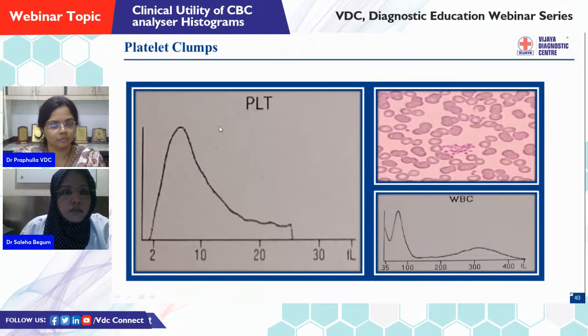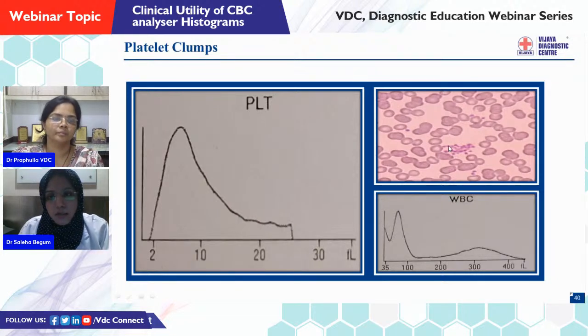This is a graph, a platelet curve starting at the baseline, but as you follow it, it is not ending at the baseline. It means that, as I just discussed, there are upper discriminator causes. One such cause is a platelet clump. You can see it here in the peripheral smear. These platelet clumps are counted as single large particles by the automated analyzer, and hence the graph ends in the middle, not touching the baseline.